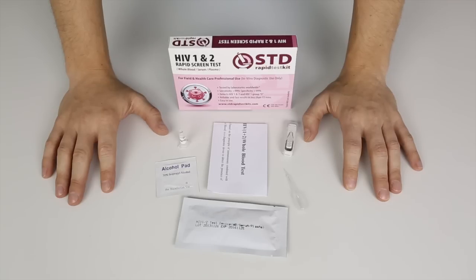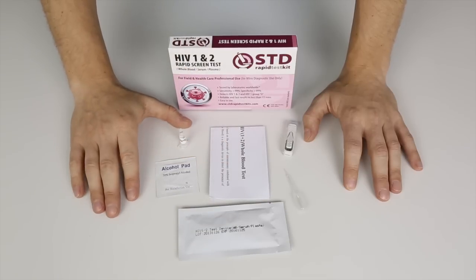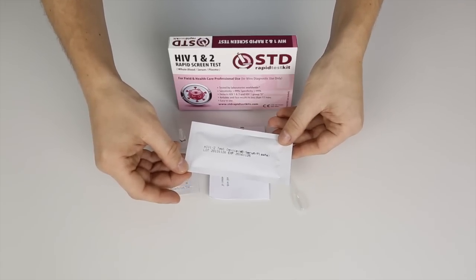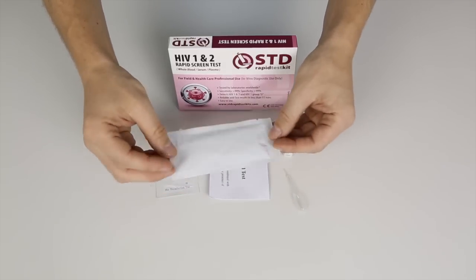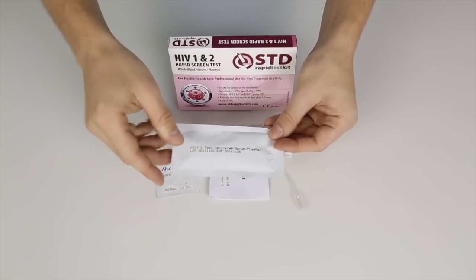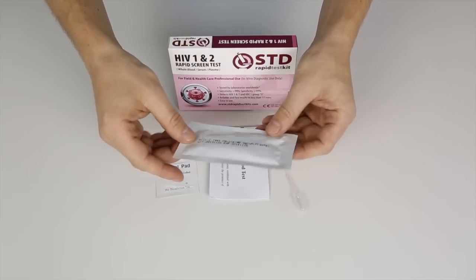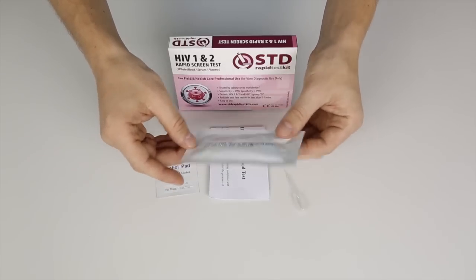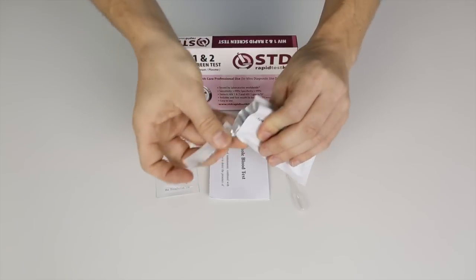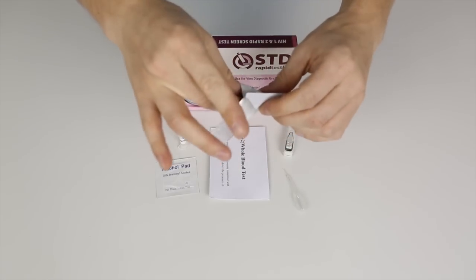In the pack you will find an instruction sheet and you'll also find the test itself. The test comes in a sterile container and on the front of it you'll see an expiration date. I'll tear it open and show you the contents, starting by opening the package and taking the contents out.